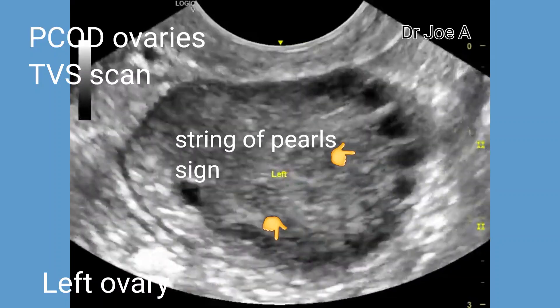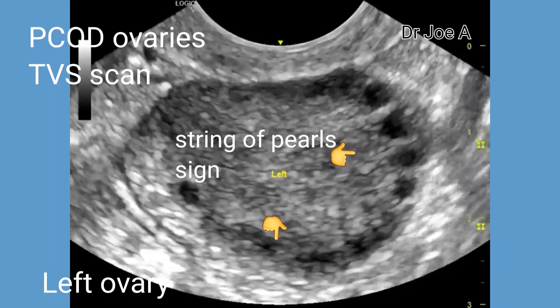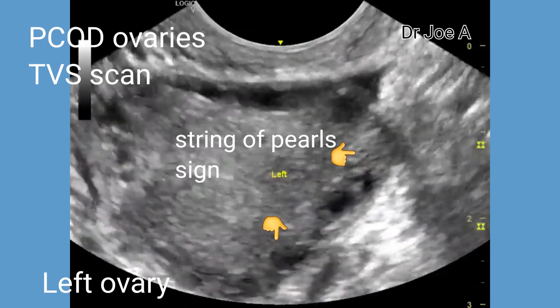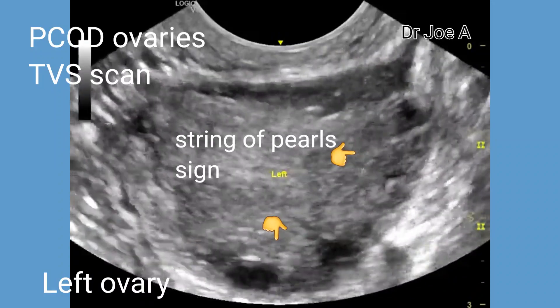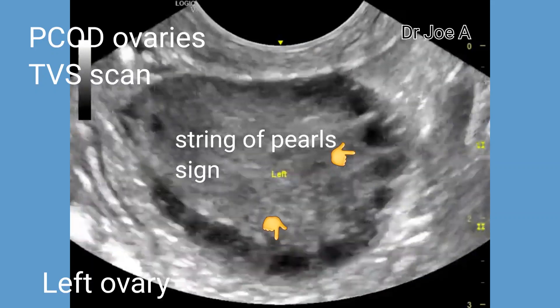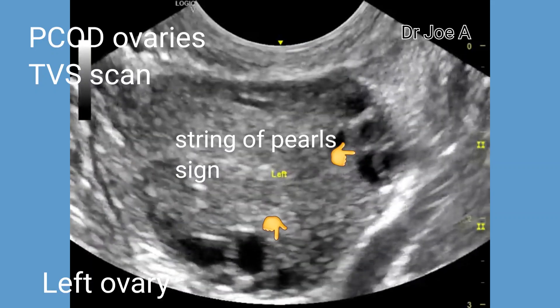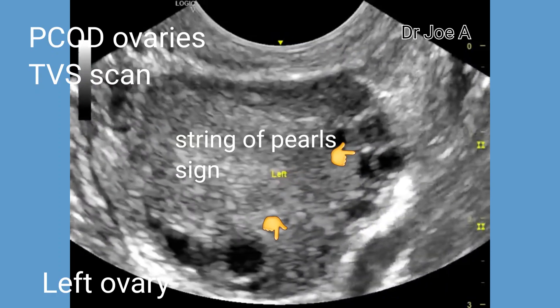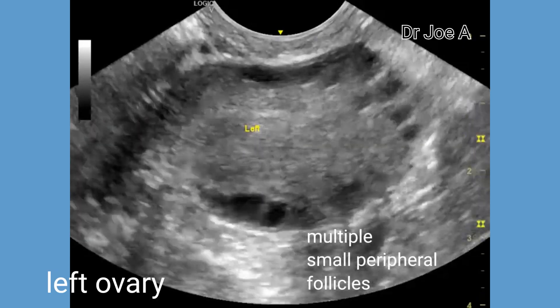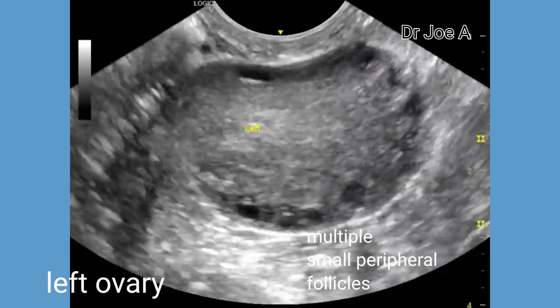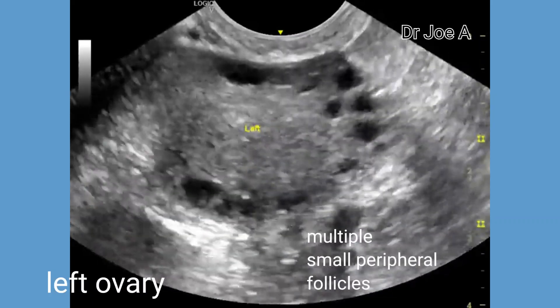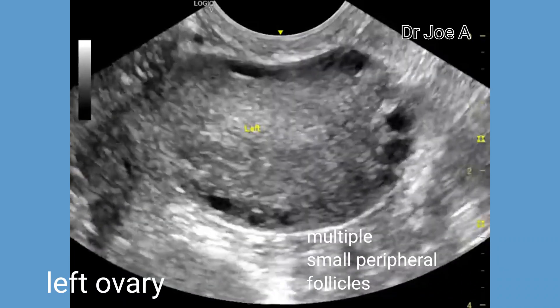This is a case of advanced polycystic ovarian disease or PCOD on transvaginal ultrasound scan. The left ovary is grossly enlarged with a string of pearls sign due to small follicles arranged along the rim of the ovary. The volume of the left ovary is more than 17 cc. Also note that the ovarian stroma shows increased echogenicity or is hyperechoic.